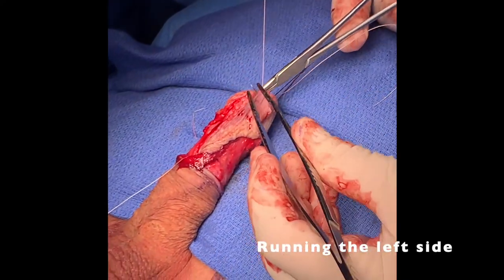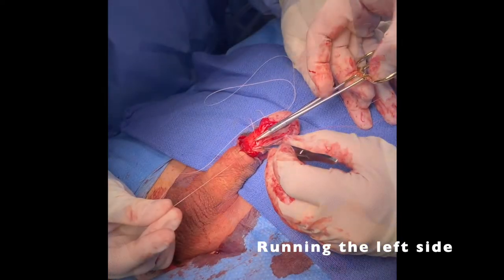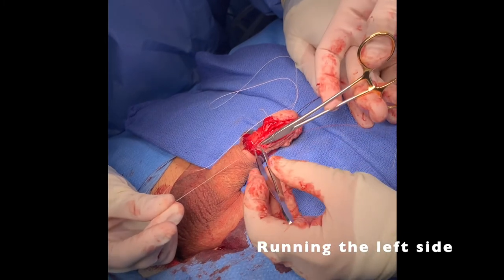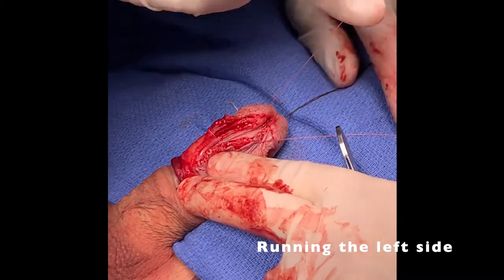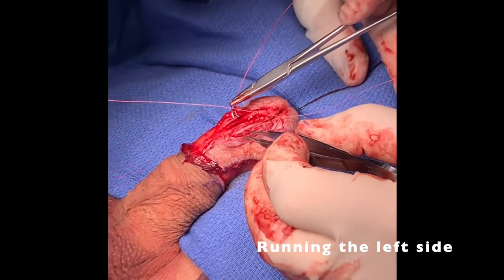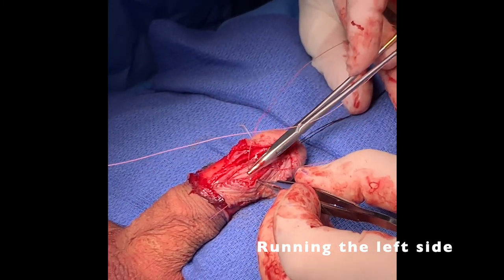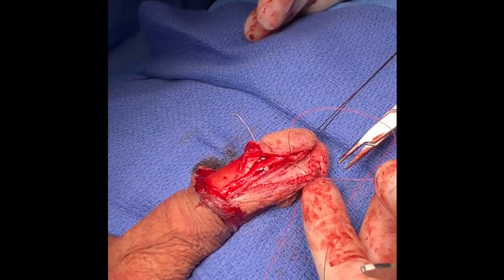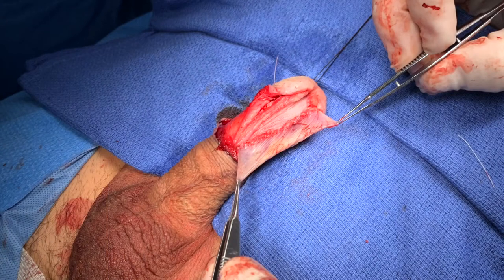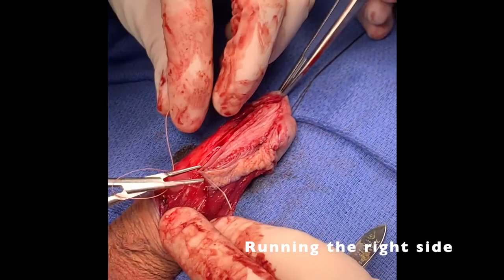Starting with the left side, a 6-0 vicryl continuous running suture was used to fix the flap to the urethral mucosa laterally, keeping in mind careful handling of tissues and that the final repair should be watertight and tension free. A running 6-0 was then used on the right side.